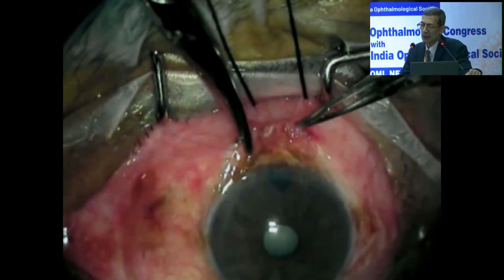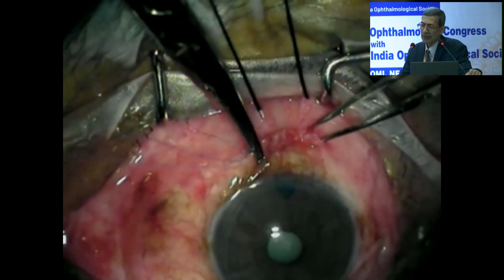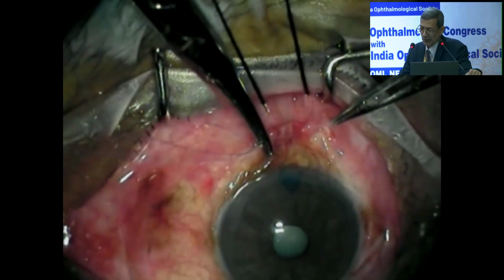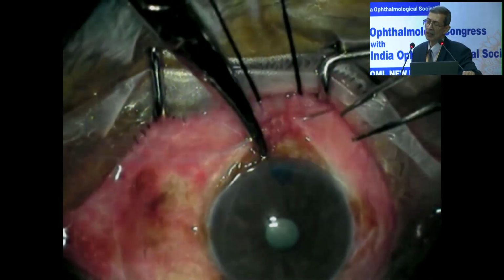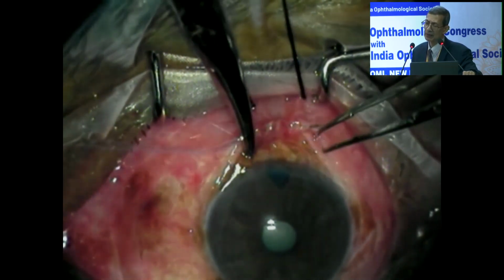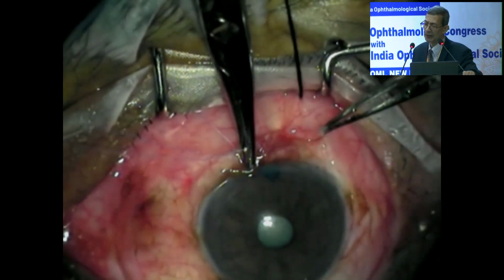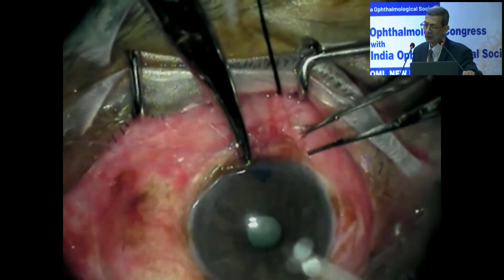But meticulous suturing should be done so that there is no gaping, and the suturing will end in watertight closure. And at the end, finally, one permanent knot will be given. You can see here, I am including the final stage of threading of the conjunctivotenon layer, and it will be closed.